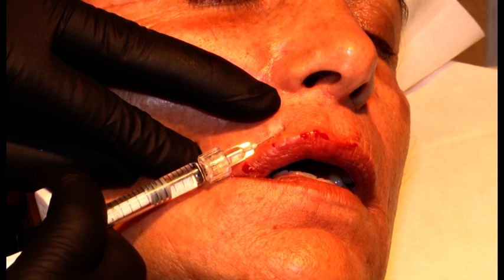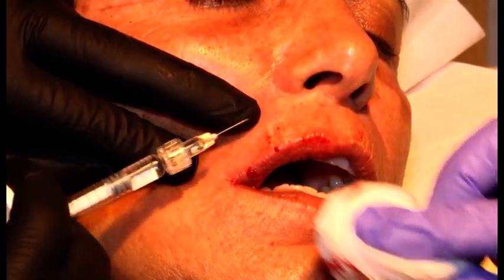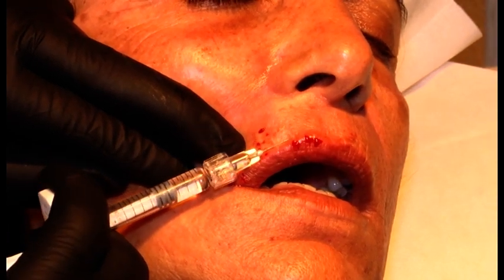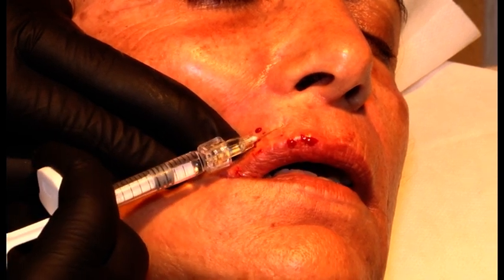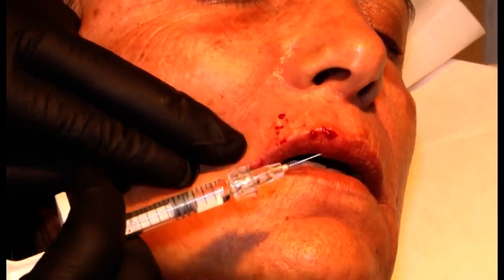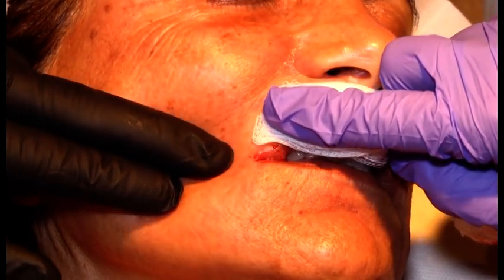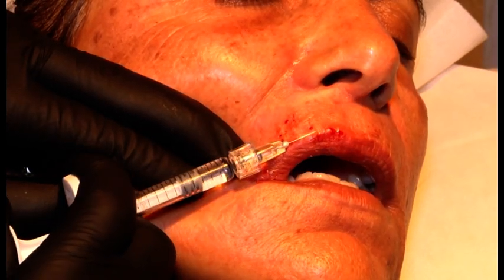It's packaged in a 0.6 milliliter syringe, and it behaves exactly the same as Balance. So I know how much force I can apply to the plunger in order not to overcorrect, but to give a nice correction. Thank you, Orit.